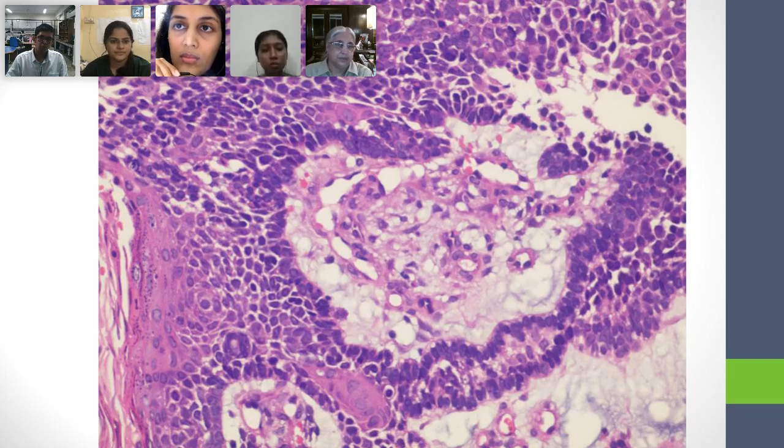No, ma'am. The architectural arrangement is properly aligned. Architecture is? See, all of you, or at least some of you, are assuming that this is squamous epithelium. Suppose it is not squamous epithelium? And you have this basaloid palisading at the periphery, and you notice something which Dr. Asavari showed you so beautifully that day.